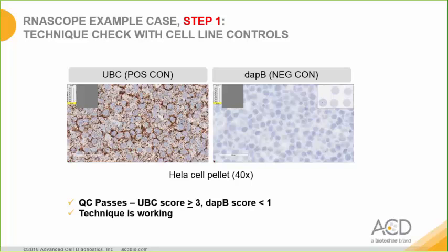In this technique check, UBC was used as the positive control probe on the cell line. As UBC has a moderate to high expression level, in order for a sample to pass, it must score at least a 3. So most cells must have at least 10 dots, which this cell line does. Also, the negative control has no staining, so the technique is good.